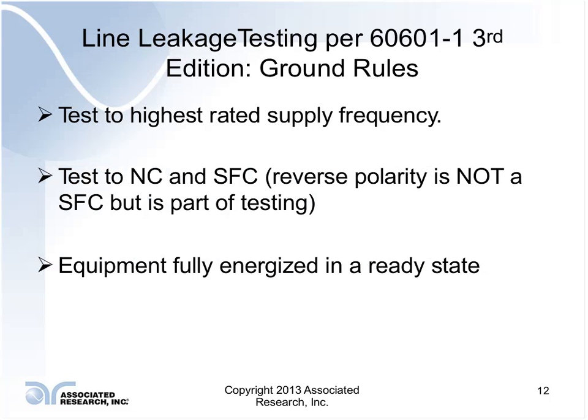The equipment has to be fully energized and in a ready state, which means if you have a microprocessor-based device, let's just say an ultrasound, that takes a minute and a half to boot up, you're going to have to fully boot this thing up for that minute and a half before you start taking your leakage readings for these readings to be considered valid.